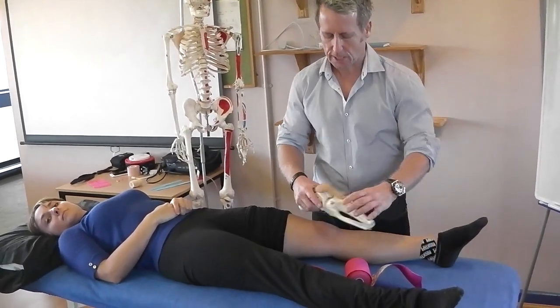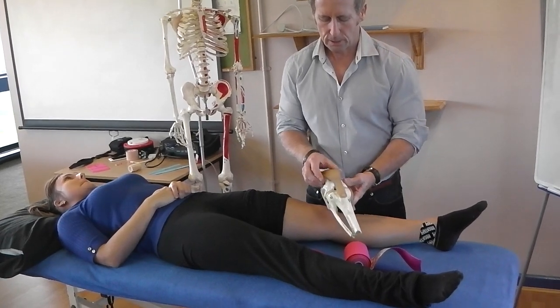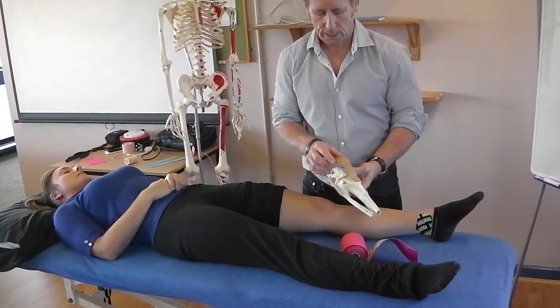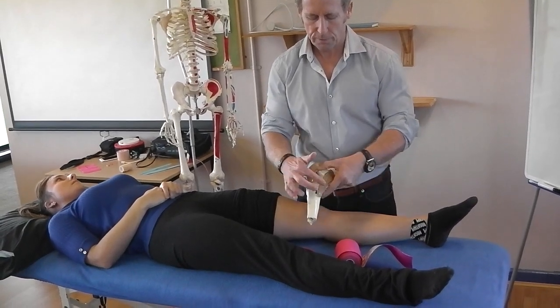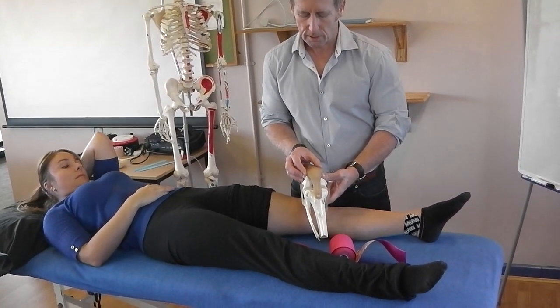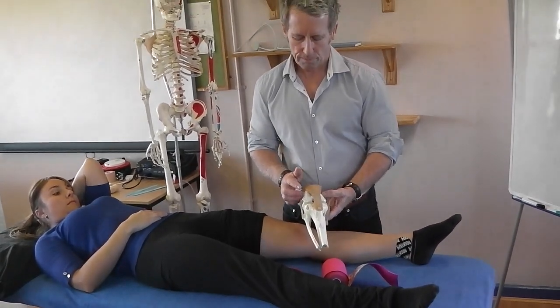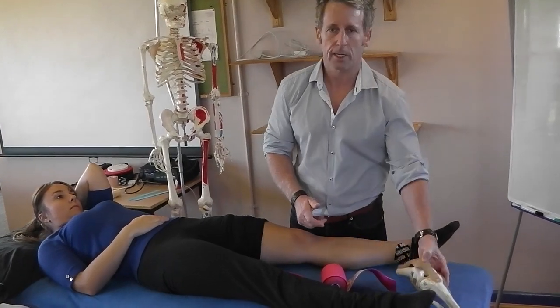If the patient has pain around the patellar area and you decide that you want to tape the knee medially — this is the MCL, this is the LCL — and you want to try to just slightly drift it over to try to realign the position, then we can use a taping technique like I'm going to show you.